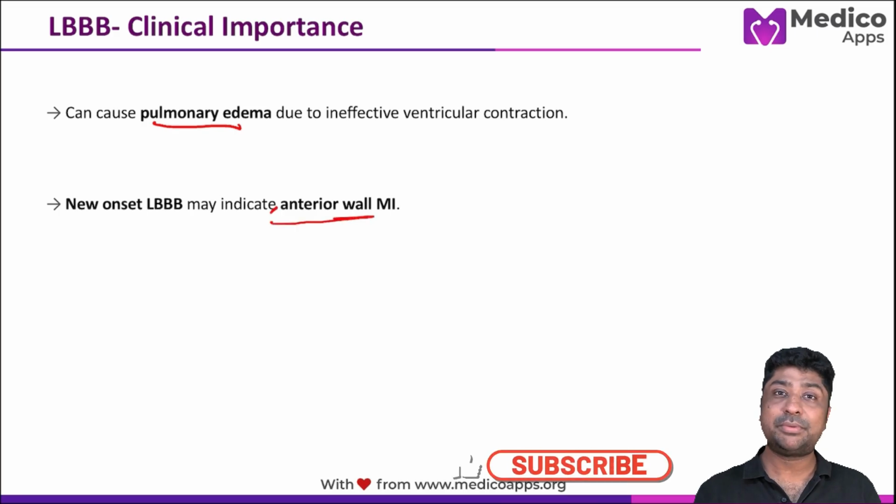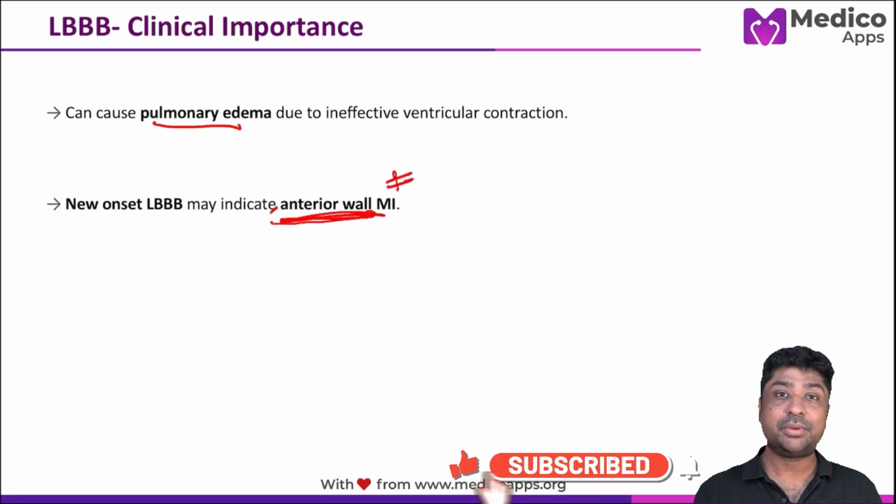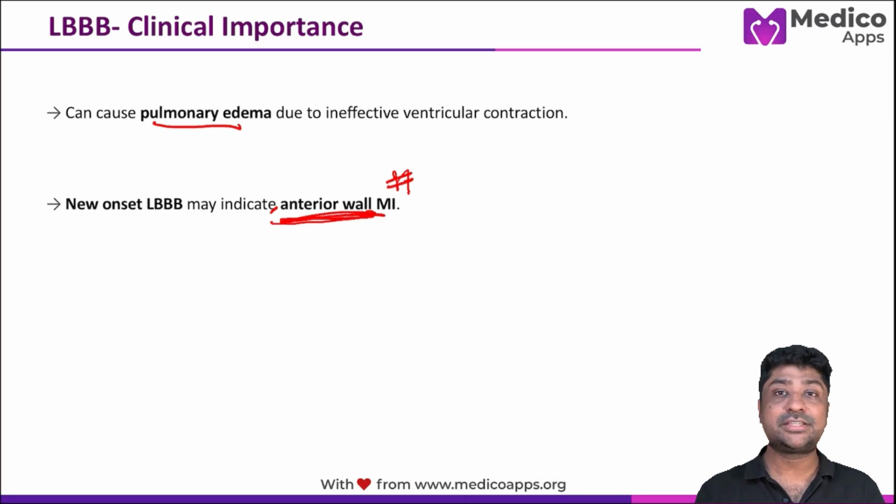New onset LBBB is clinically significant because it may indicate an anterior wall myocardial infarction. This is especially critical in emergency settings where chest pain plus new LBBB raises concern for ongoing infarction.